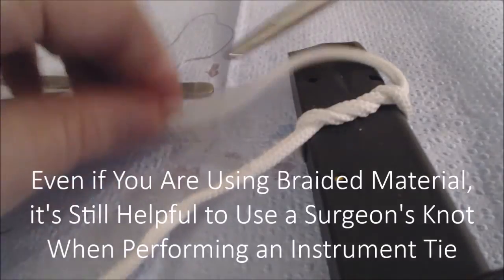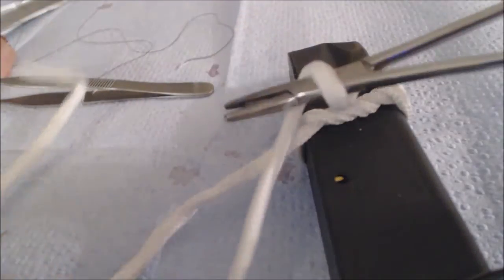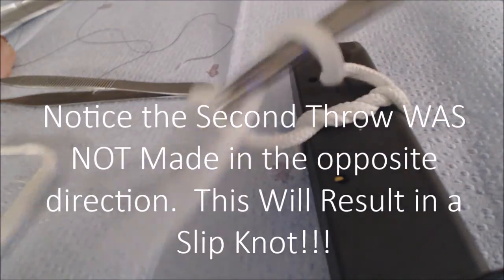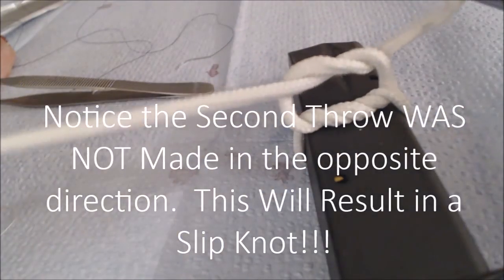A second throw will be made. We've wrapped the suture material around the instrument, gone off and found the end of the suture, and now we'll pull it through.